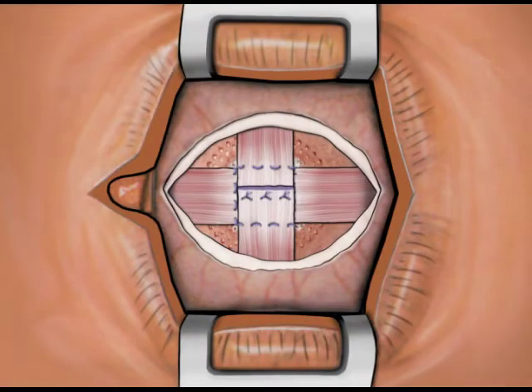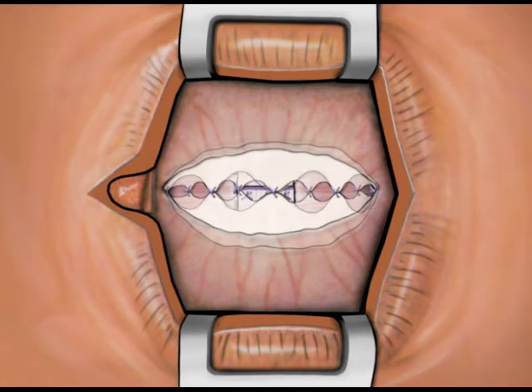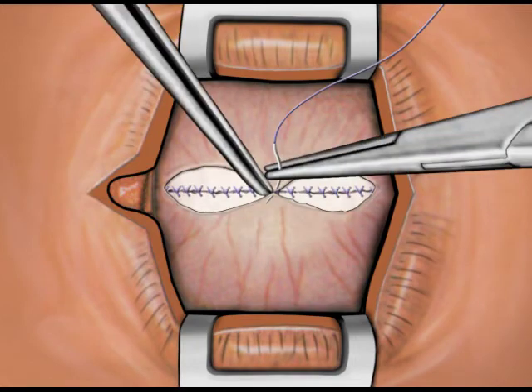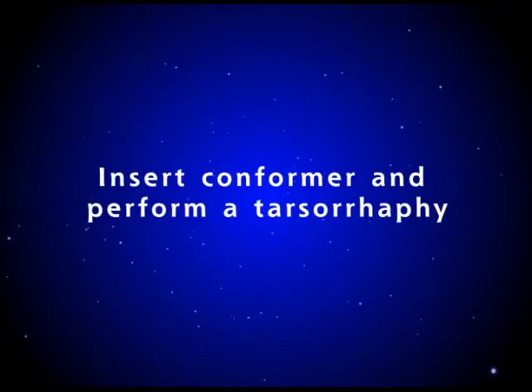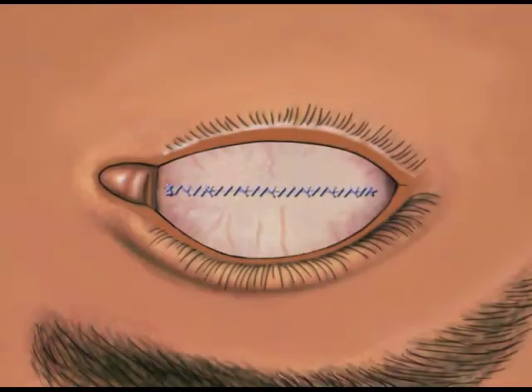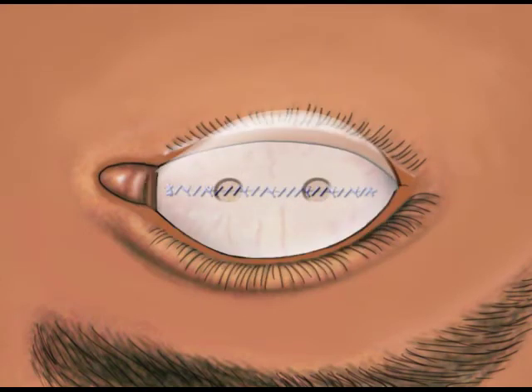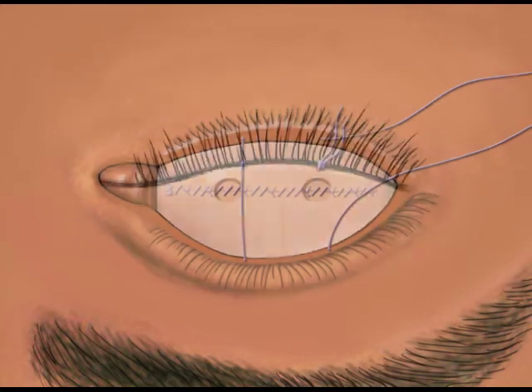Tenon's capsule is closed tightly in a separate layer using multiple interrupted 5-O Vicryl sutures. The conjunctiva is then closed in a separate layer using interrupted and running 5-O Vicryl sutures. The speculum is removed and a conformer placed into the socket. A temporary suture tarsorrhaphy is placed to prevent conjunctival prolapse.